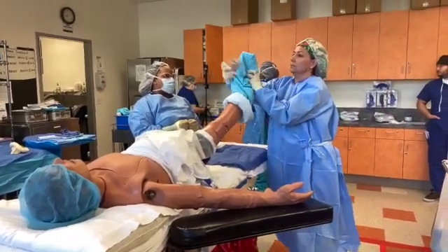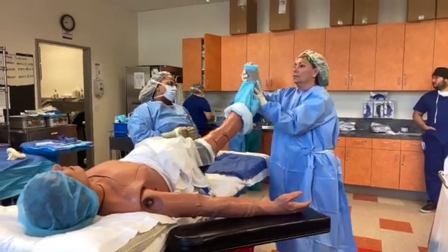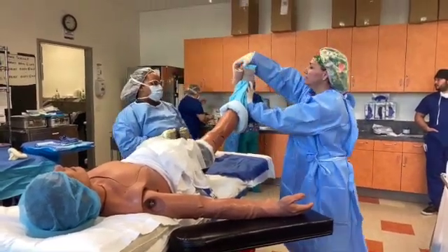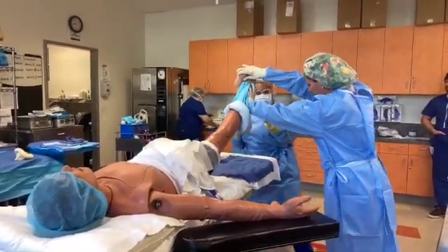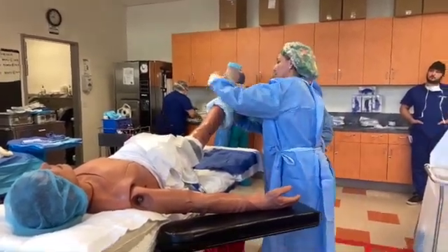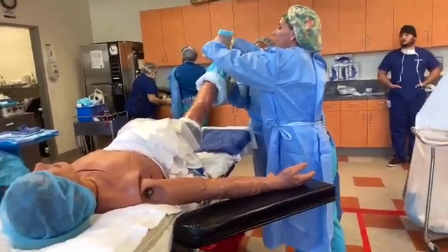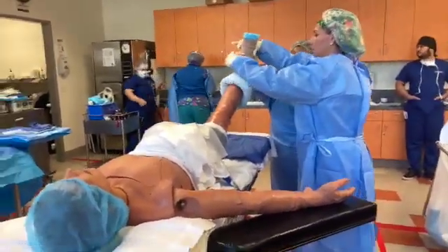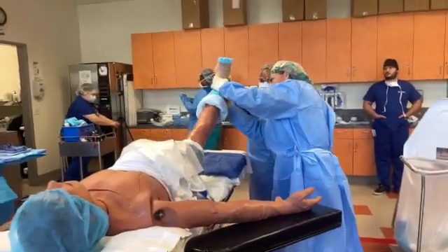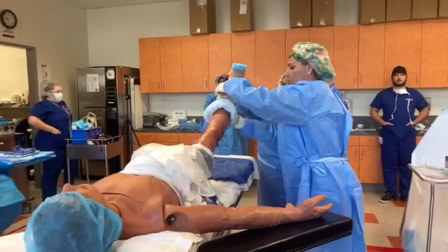When you have a circular scrub, you gotta open this one, I can't touch them. So you can hold the foot. Come over here. Body mechanics, Miss Bree. Working all over. Not too tight. Okay, now come back up here to the foot, please. It's all right. Doing the stockinette first, yes.